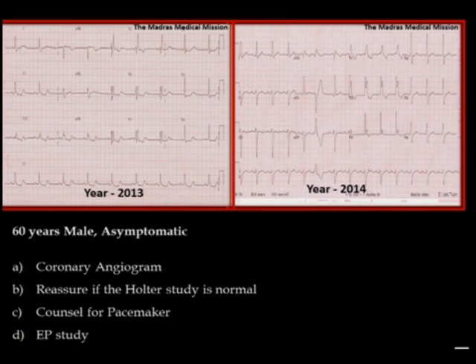EP study could have been all right if he had come specifically for the evaluation of the need for the pacemaker in asymptomatic status. But in this case, the EP study situation is different.